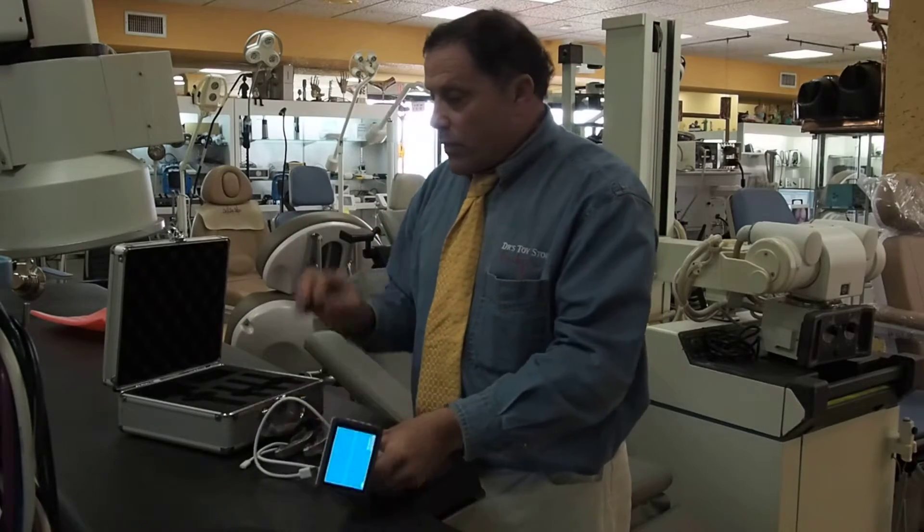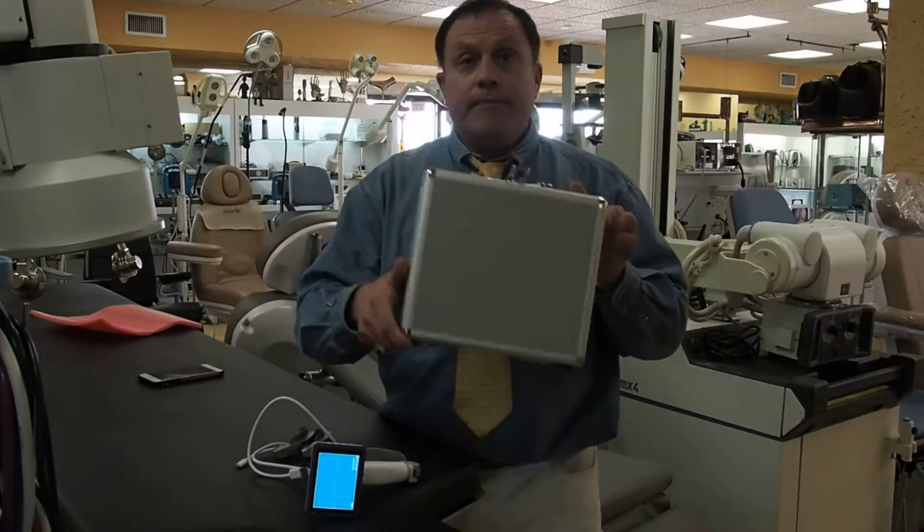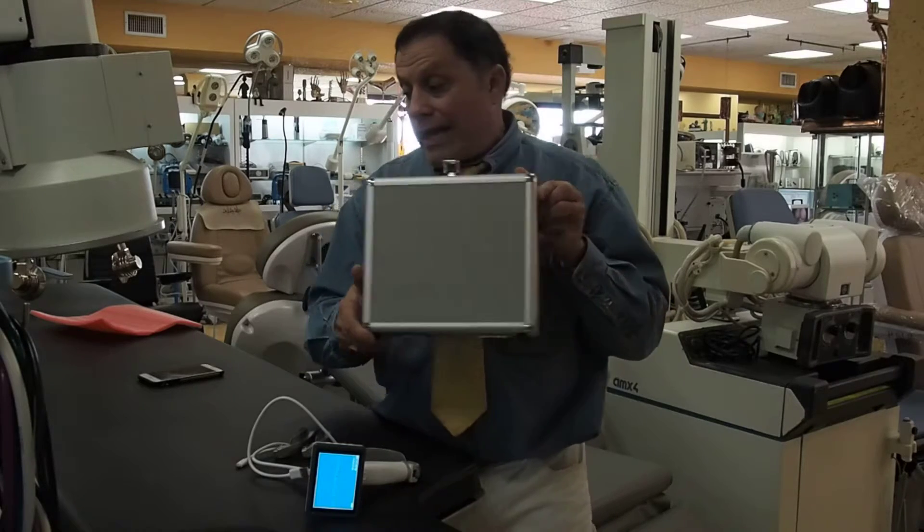You've got three different sizes and a really nice case it comes in. It's called the doctor's toy store for your GlideScope, your power chairs, your lights, your liposuction, all your anesthesia equipment. 877-DRS-TOYS.